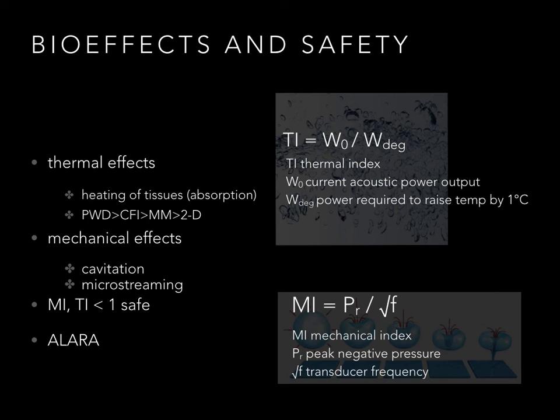Because there is a potential for bioeffects to occur, the ultrasound equipment must be operated as safely as possible by applying the ALARA principle. ALARA stands for as low as reasonably achievable. This means that ultrasound examinations must only be performed when clinically indicated and only for the shortest possible time with the most optimized images.